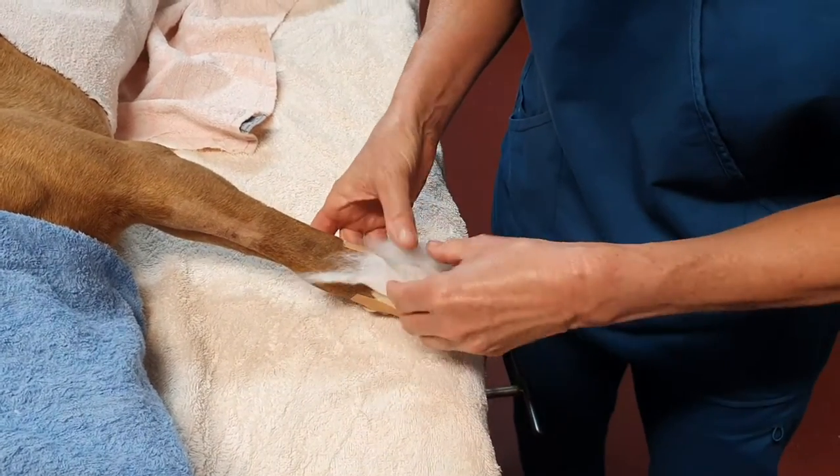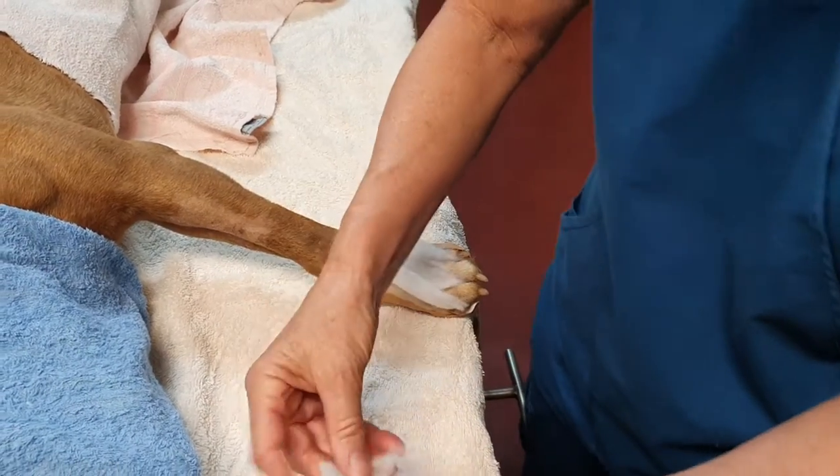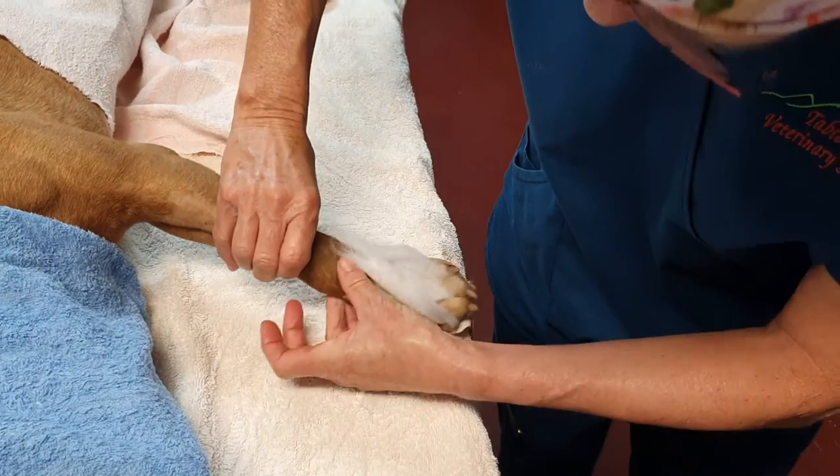These may well fall out fairly soon after having put the splint on, but at least they've spaced out the toes while we apply the splint. Let's not forget our dewclaw — pop a little one under there like so.